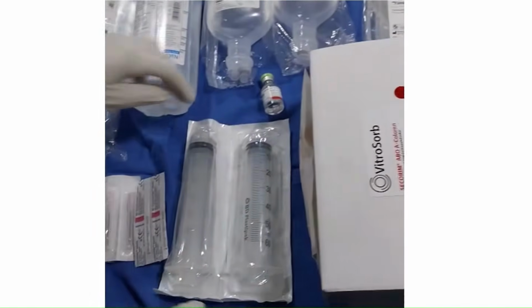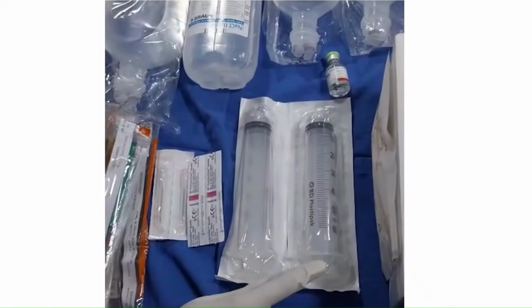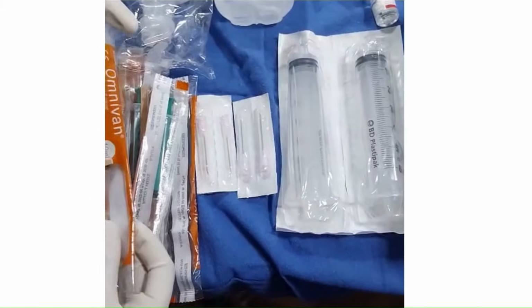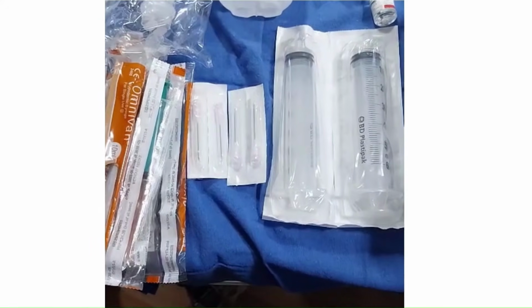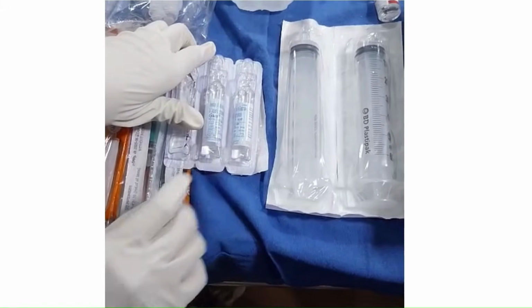Next, we are going to take 25,000 units of heparin, which is used for priming the device. Next are the 50 cc short tip syringes, a 16 gauge needle, and 10 cc loading syringes. Calcium gluconate is to be taken according to patient body weight and diluted in 100 or 250 ml NS and given throughout the procedure.